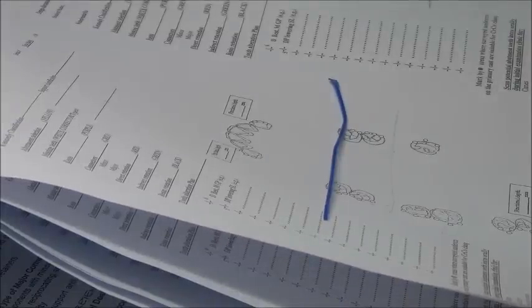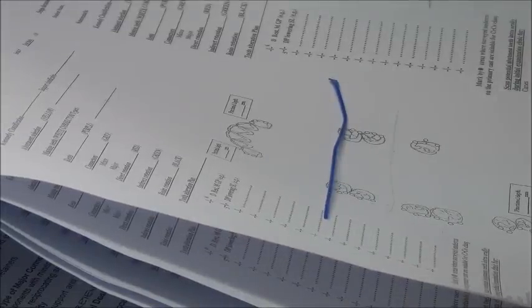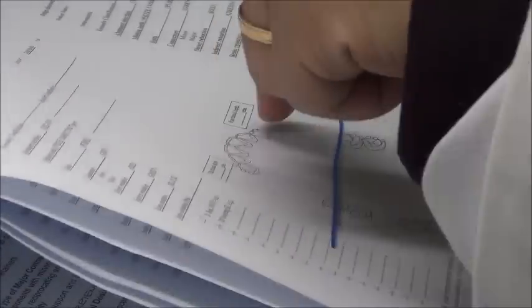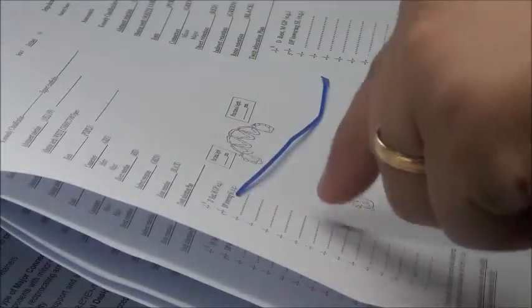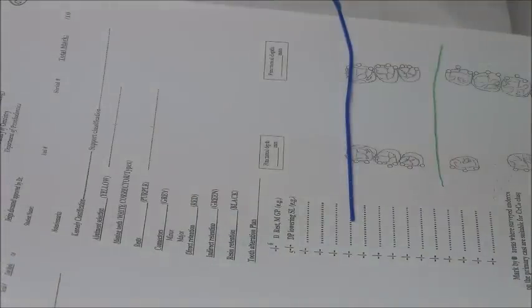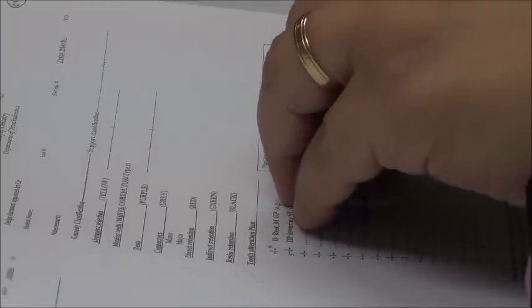These anterior rests are preventing the rotation there. Okay? This is called quadrilateral support. 4 rests are present, 2 on each side. In these, I don't need to add components for indirect retention. Go here. In this case, do I have quadrilateral support? No, I have to add components for indirect retention.